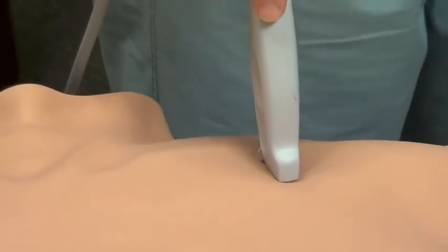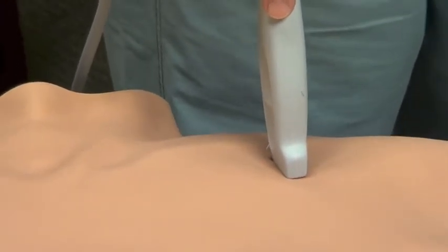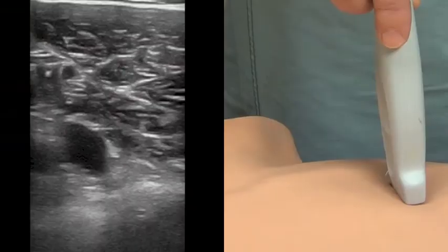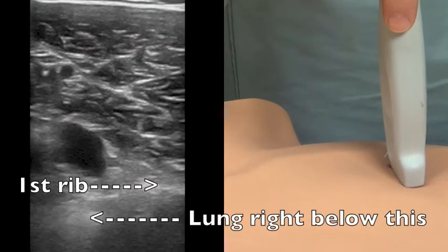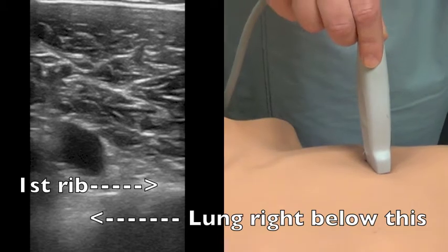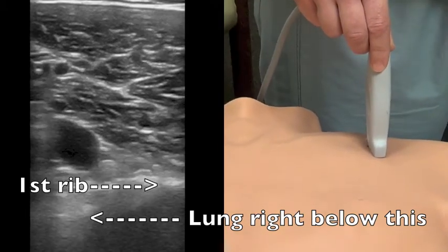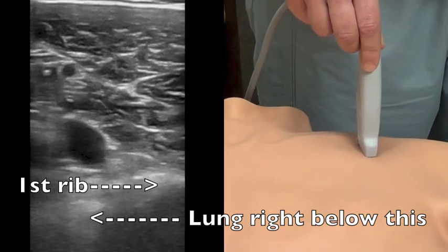From this position we actually have a good view of both the vein and the artery. Also, usually in this position we can visualize the first rib, as it serves as almost a shield or barricade between the vessels themselves and the lung parenchyma underneath.